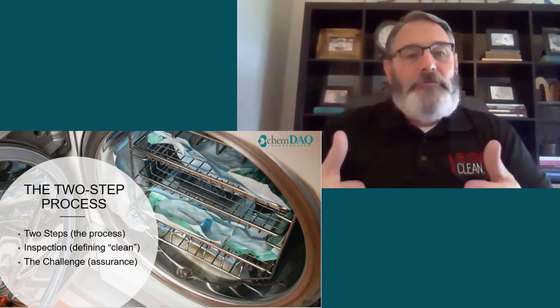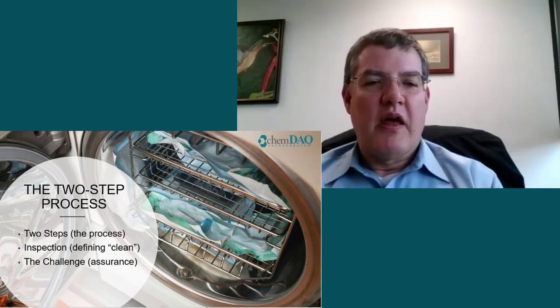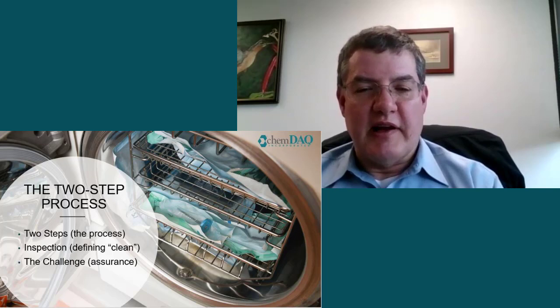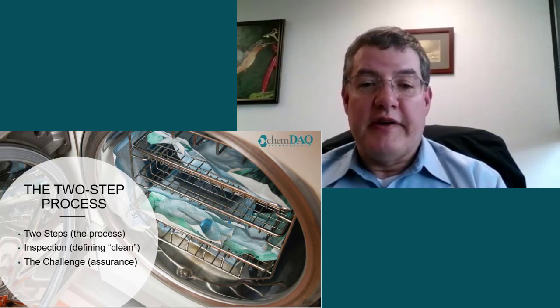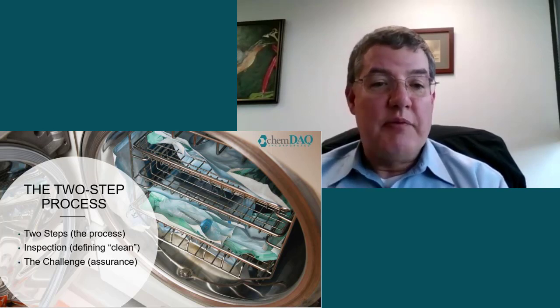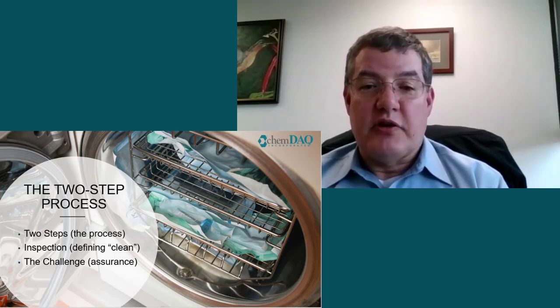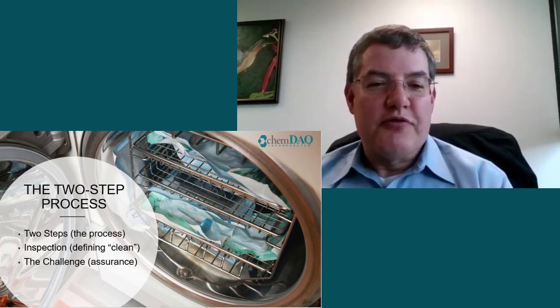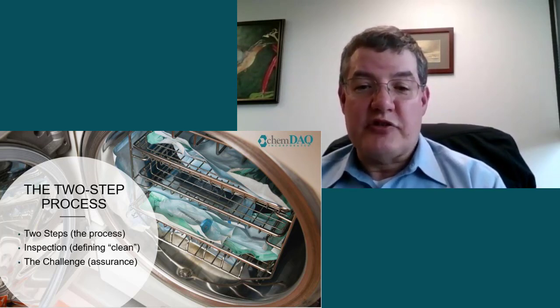So, Richard, if a healthcare facility doesn't have these other modalities for disinfecting these masks, can they still be sterilized? The requirements needed to say that something is sterilized is very high. Less than a 1 in a million chance that a viable pathogen is still there. Hydrogen peroxide and ethylene oxide are both very effective disinfectants and sterilants, and they will disinfect all surfaces. But if there are any large globs of contamination, for want of a better word, the hydrogen peroxide and ethylene oxide are not likely to reach the interior, so the best we can claim is disinfection.